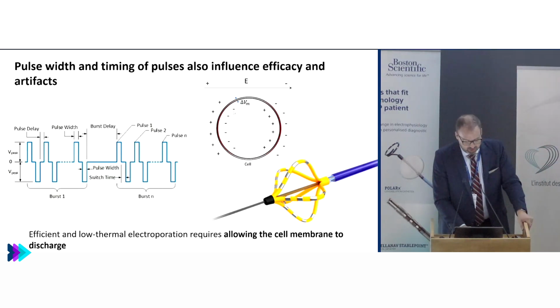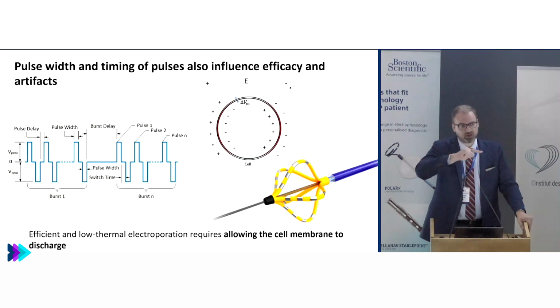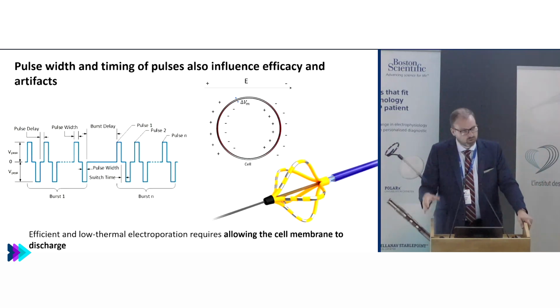So we want to basically play with the pulses to charge and discharge the membrane. We want to do two things: avoid bad stuff, and be efficient. A defibrillator is not efficient. You're actually overdosing by quite a bit with that large pulse, especially if you were to repeat that pulse many, many times. So we want to dose just enough to get to our maximum effect, but not so much that bad things happen, or so much that we're harming our generator, because this can be really hard on the generator.